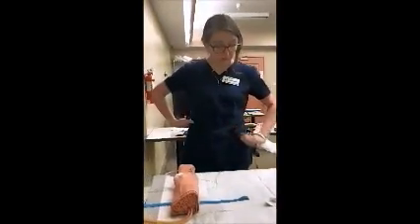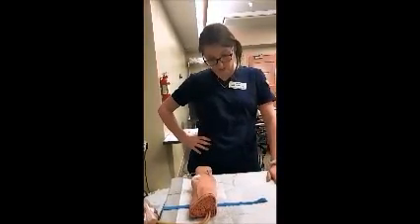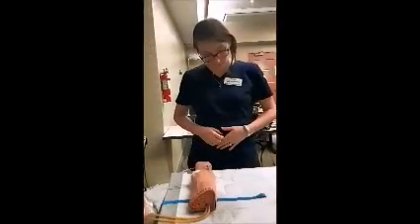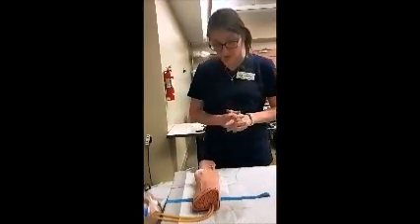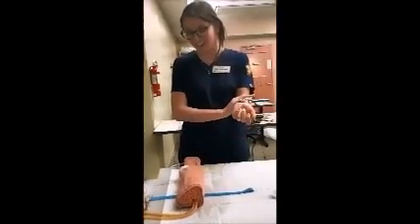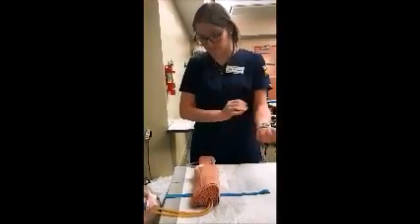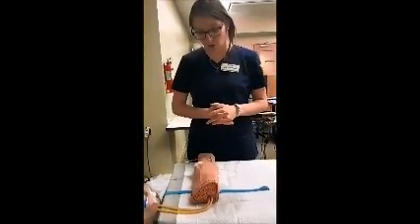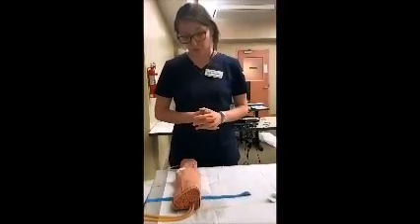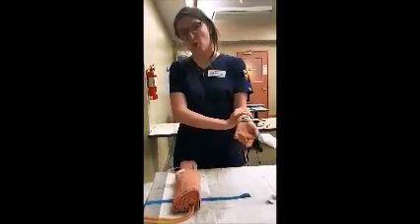All right, just bear with me. So what I want you to do for me is be kind of on the prowl for weird side effects going on, okay? What I want you to watch for is redness, swelling, any irritated looking skin, like when you get a scratch and you itch it and your skin turns red. Kind of look for that. And then you're going to want to see if it gets what we call infiltrated. It's a kind of a weird word, but basically what we're looking for is if it turns white and it gets cold to the touch.